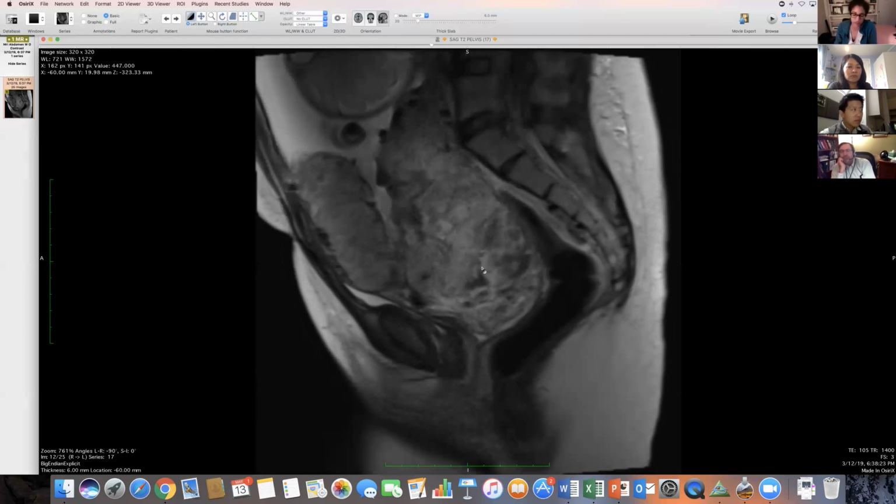They do tandem and ovoids, basically intracavitary radiation for cervical cancer now. And we'll get MRIs of it. So you'll see a rod going into the cervical cancer. And after one round of radiation, it's completely melted away. The tumor has disappeared. But they're inpatient when they do that. So they leave the rod in and they basically give 24 hours of radiation. And then when they get their post-op scan, sometimes the patients even deliver their tumor. It just sloughs off, and I'd rather deliver it than have it.